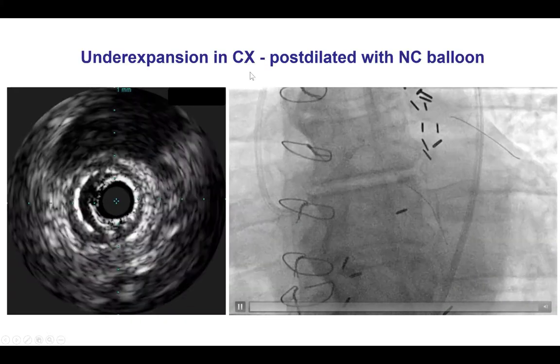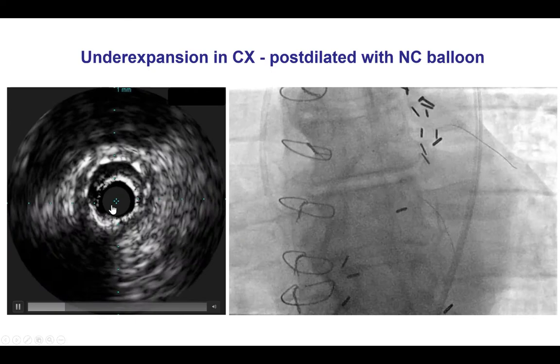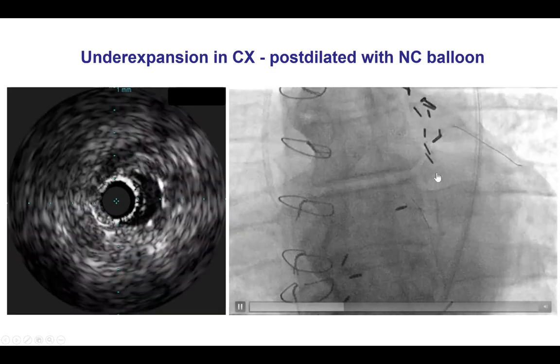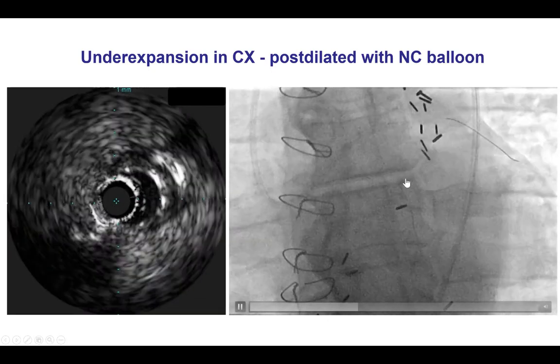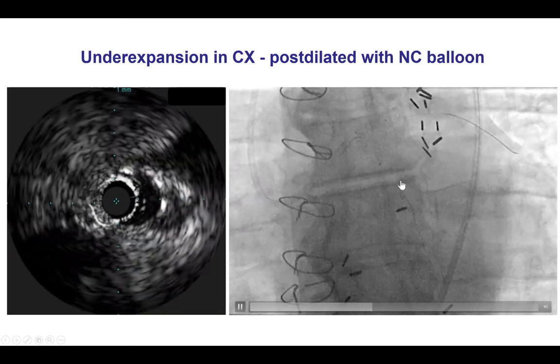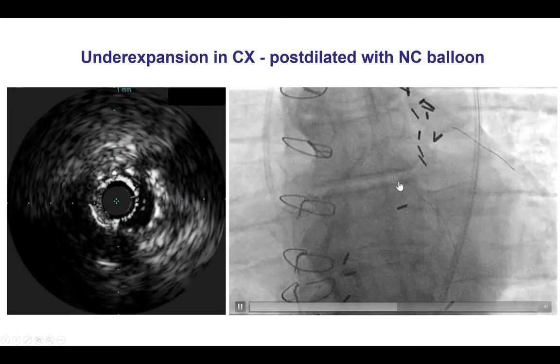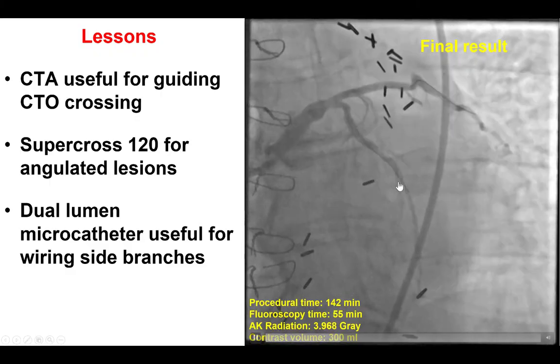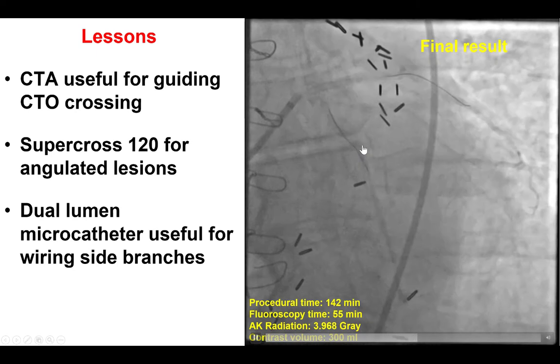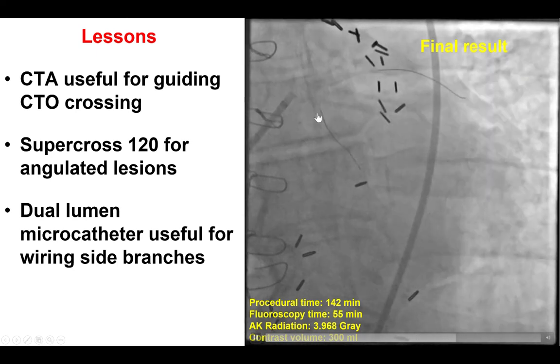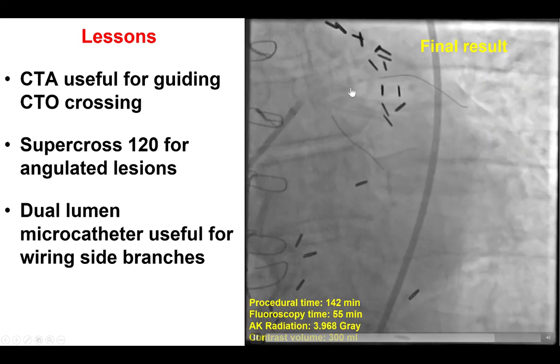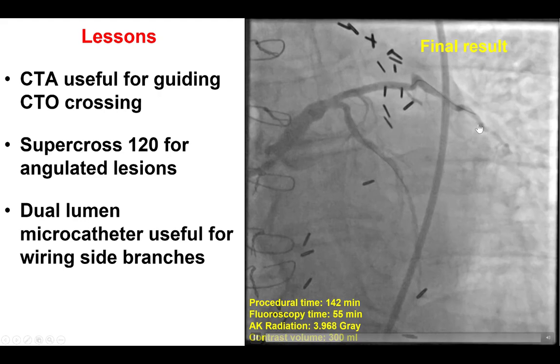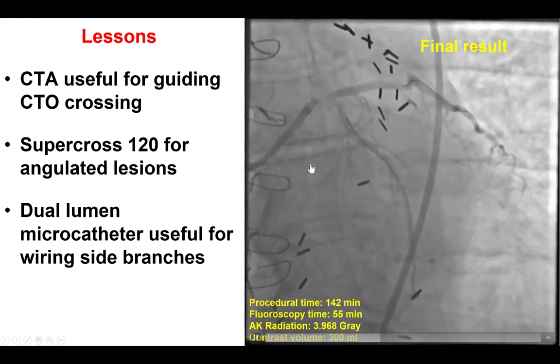The circumflex stent was underexpanded as seen by intravascular ultrasound, so we performed high-pressure balloon inflation with a non-compliant balloon. After doing that, we restored flow into the distal circumflex while maintaining good flow into the LAD, which of course was occluded further down.